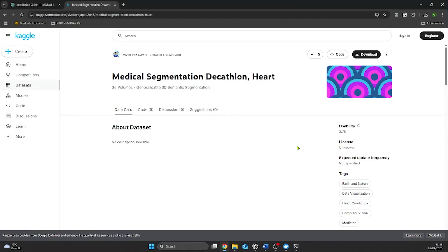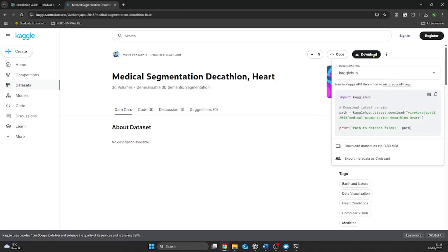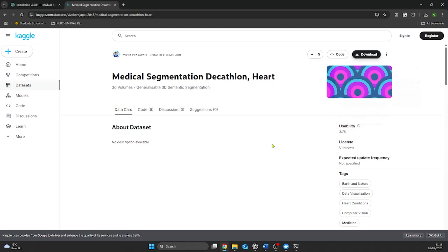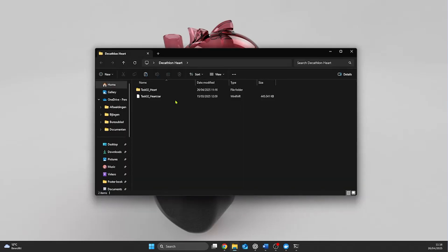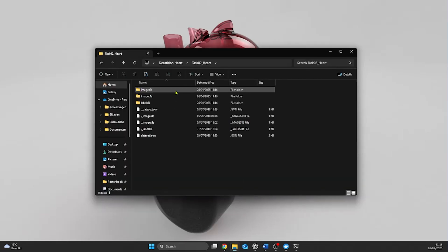In this video I use a publicly available data set from Kaggle. It's the medical segmentation decathlon for the heart. It includes 20 CT images of the heart and their corresponding labels of the left atrium for training. It contains an additional 10 images for testing.